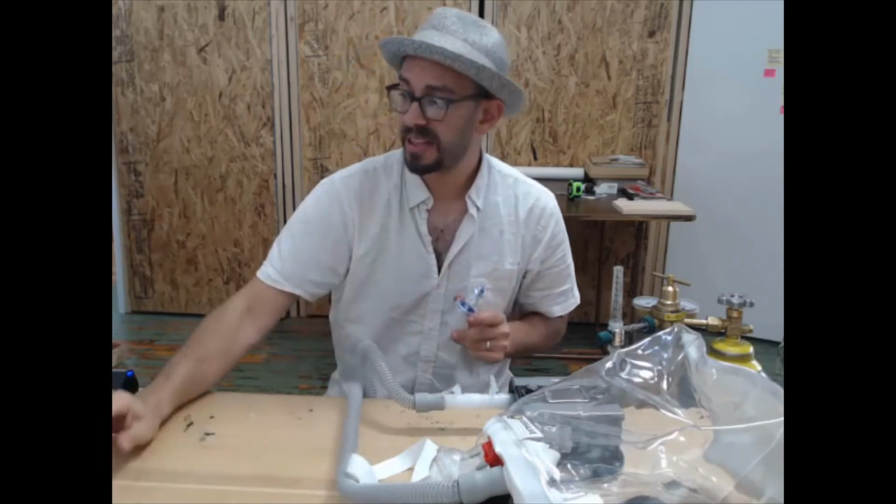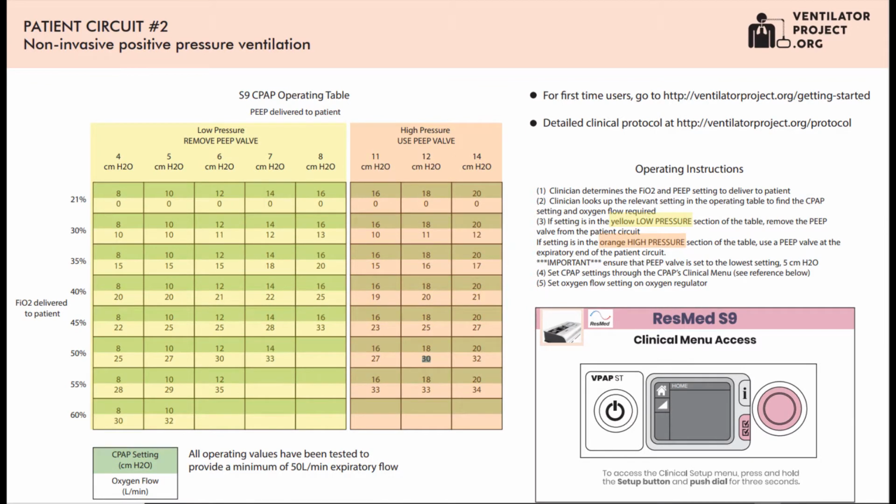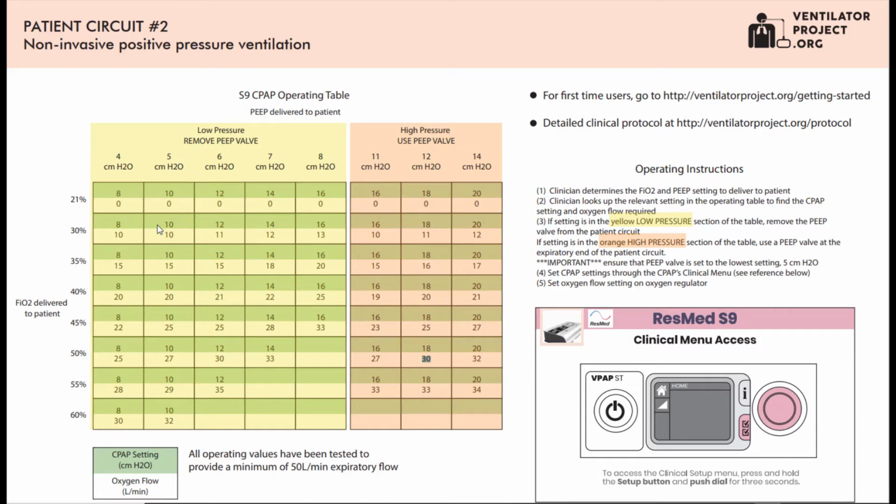Let's talk about that a little bit. This is what's called the operating table. If you look at it, there are two regions of this: the yellow region, which is low pressure, and the red region, which is high pressure. Most of your work is going to be in the yellow region. And when you're working here, you do not use the PEEP valve.